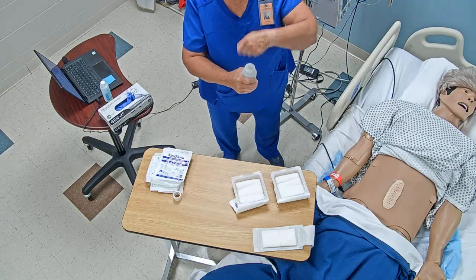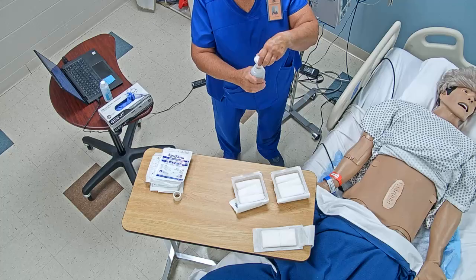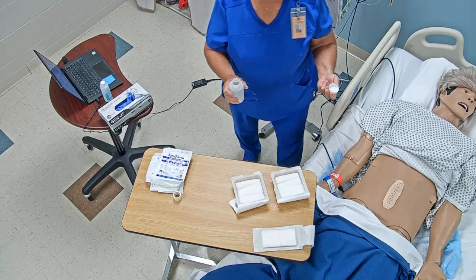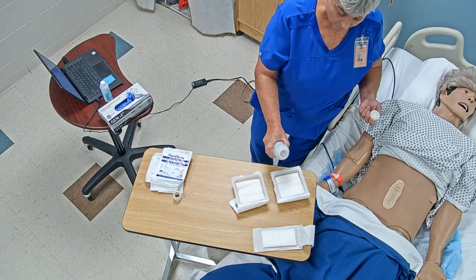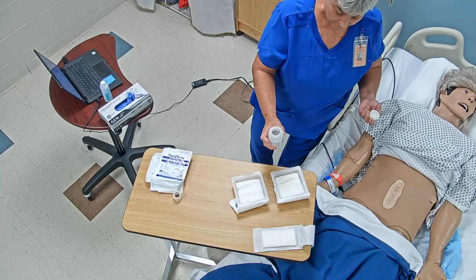I'm going to take my seal off, open it, and I'm going to go ahead and just lip a little bit. Now I want to pour from the same side that I lipped. So you see me kind of moving over here, and I'm going to go straight in without my hands going over, and I'm going to pour my solution on there, okay?